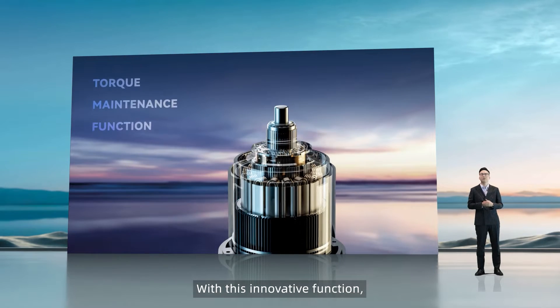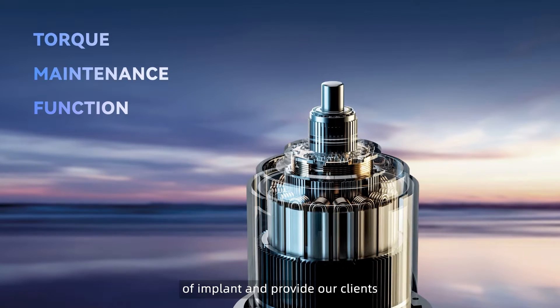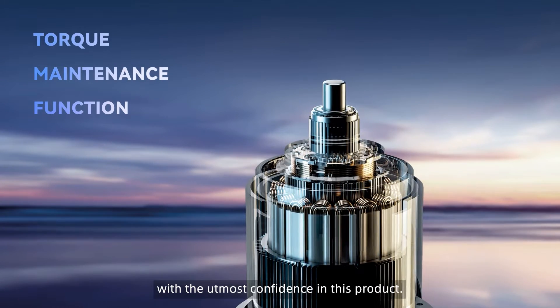With this innovative function, we can guarantee the stability of the implant and provide our clients with the utmost confidence in this product.